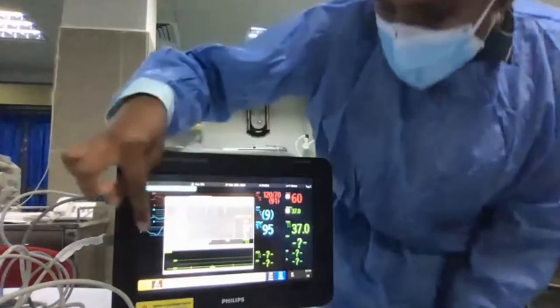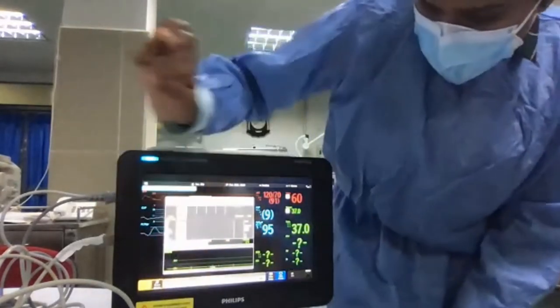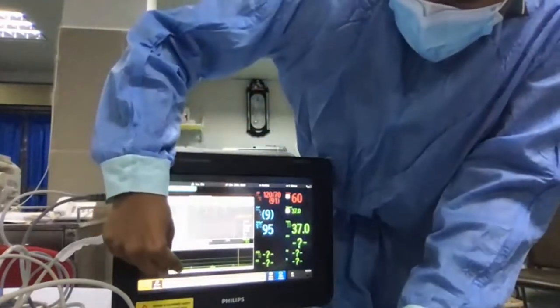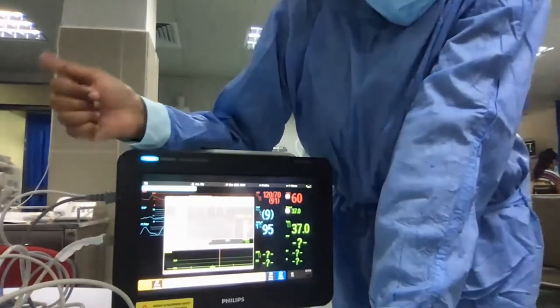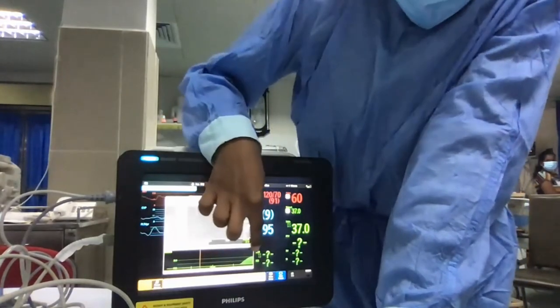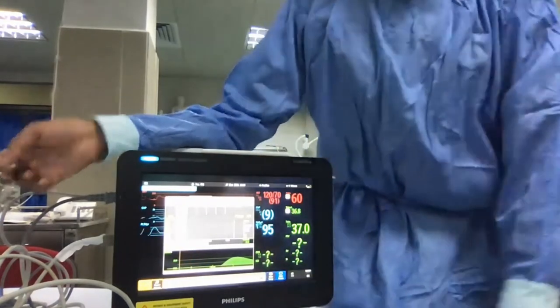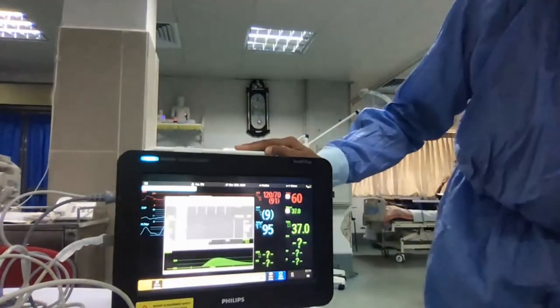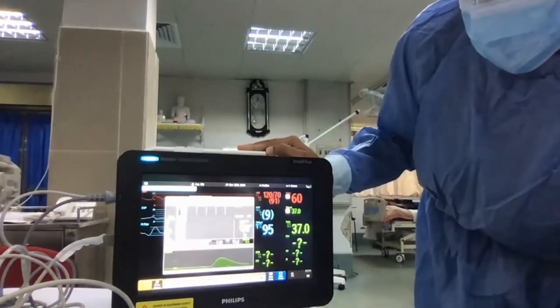Then I will do a demo injection here. I will just click on demo inject. So here, injection detected. You will get the message like this when you are doing it live also. A curve like this will appear. That is the ideal curve that you should see. It looks like a normal distribution curve. It should have a very nice upstroke and a downstroke. Otherwise it is not a proper bolus.